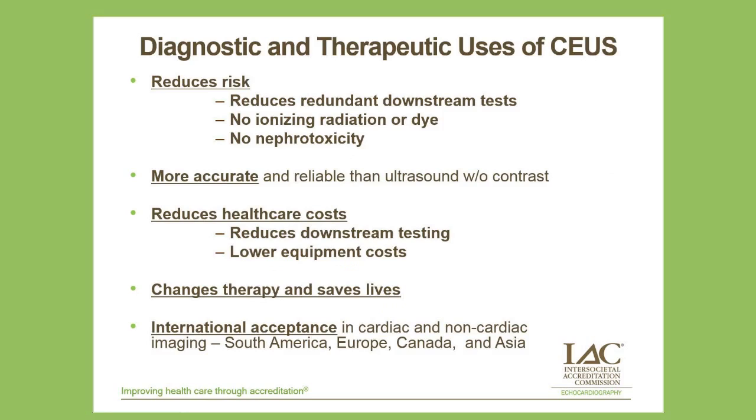So, diagnostic and therapeutic uses of contrast-enhanced ultrasound. It reduces risk. It reduces costs. It's not toxic. It is more accurate and reliable when you use contrast than without contrast. Healthcare costs are reduced. It actually saves lives and changes therapy, and it's internationally accepted.